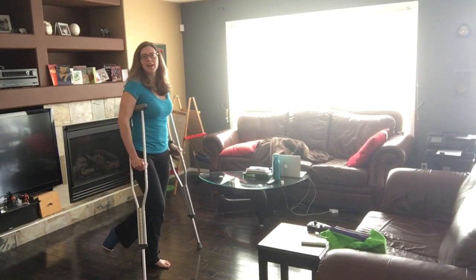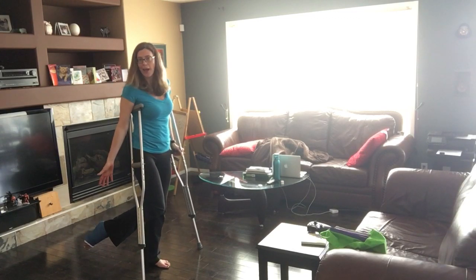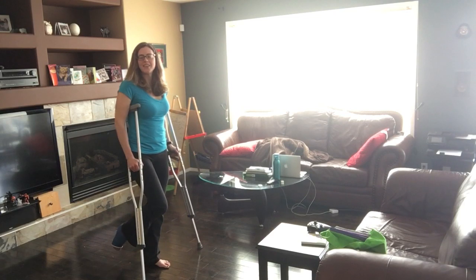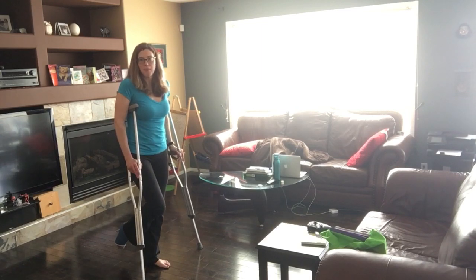So I ruptured my Achilles tendon, had it repaired, and I'm in this cast — this Girl Guide blue cast. I can't put my foot down at all when I'm walking, so I need the crutches to basically be my other foot.